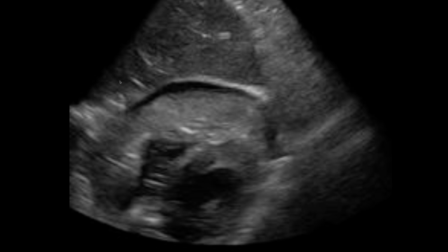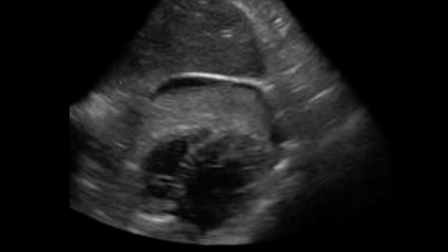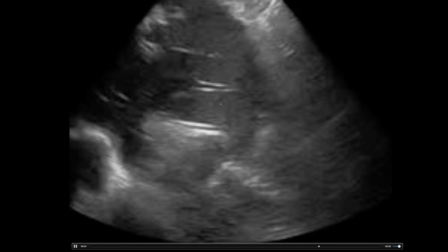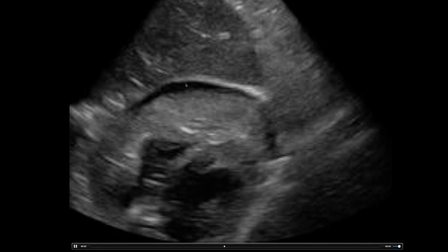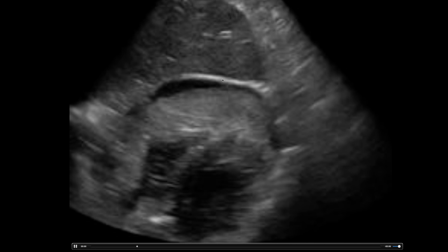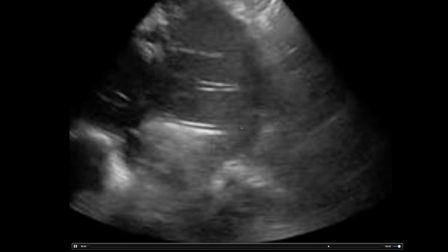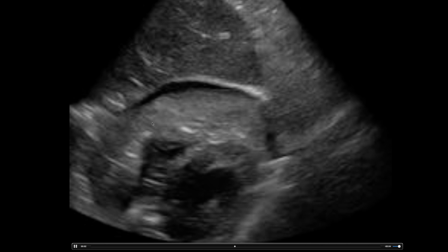This patient, similarly to the one we discussed earlier with the right upper quadrant, notice how blood clots, and you'll see this. This is actually a heart here, liver. Here's your pericardium, this bright white up here. And then between your heart and your pericardium is this mass, this kind of globular mess. Some of it looks fresh and black and anechoic. The rest of it carries this texture to it, which is actually clotted blood. So this is a hemorrhagic tamponade.